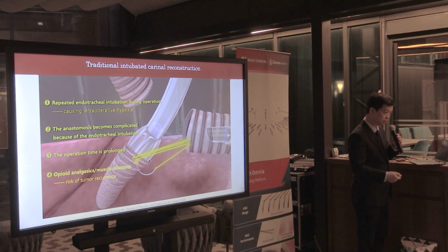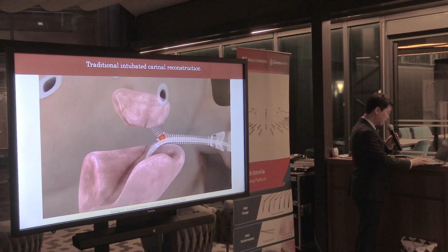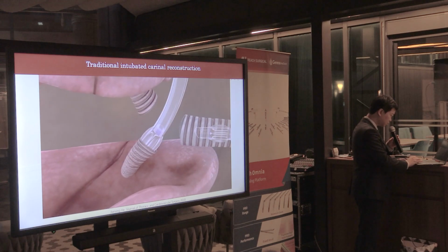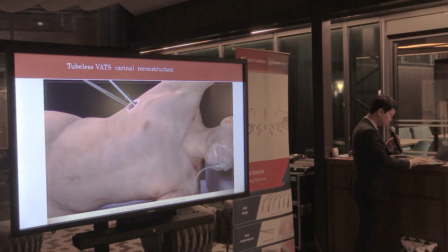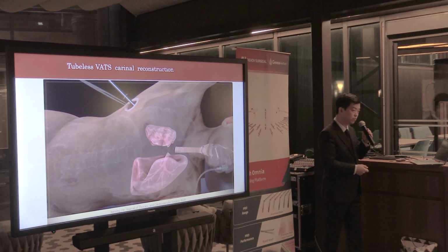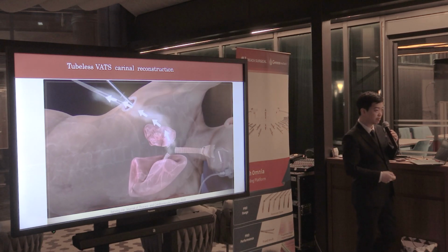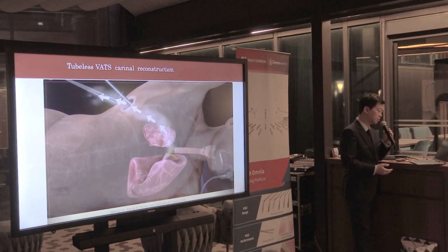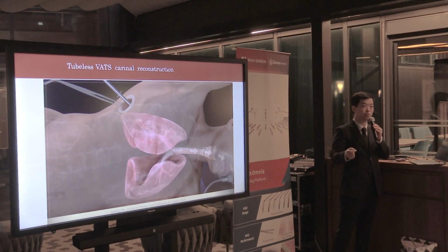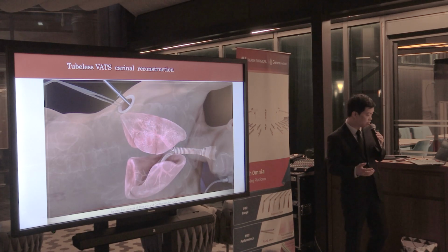And repeat the intubation, so we can complete smoothly. And now, what should we do? In our center, we can complete carinal reconstruction unintubated. That means the patient just keeps his spontaneous breathing, and without the intubation, we can complete the anastomosis. We can complete this procedure smoothly.